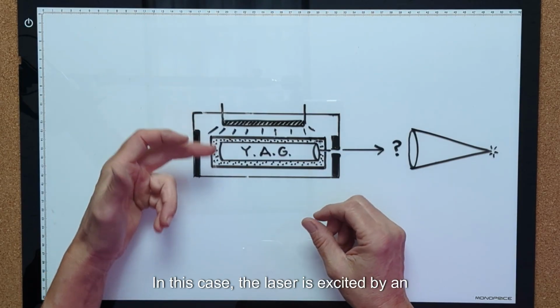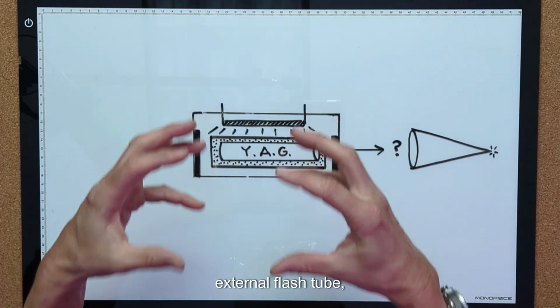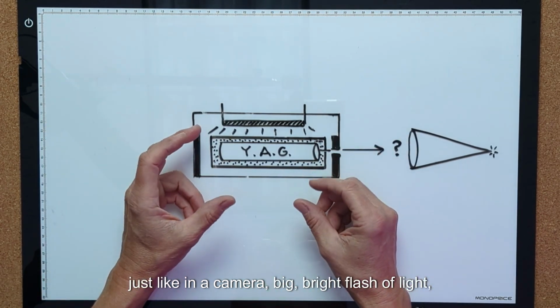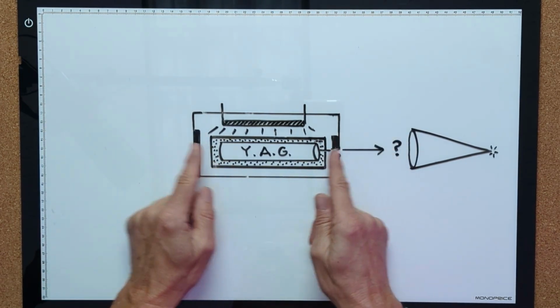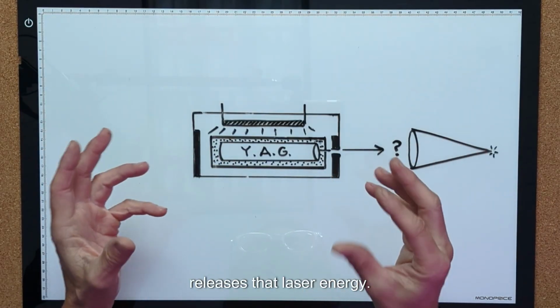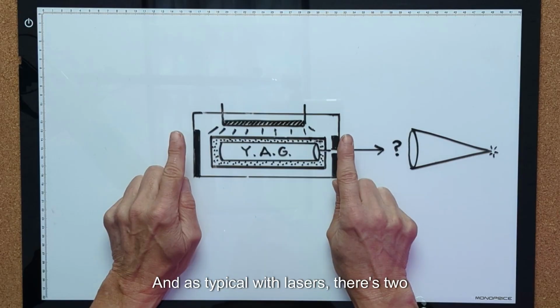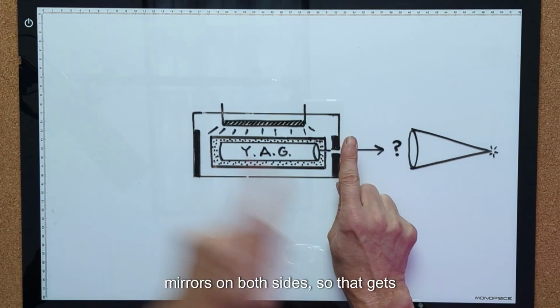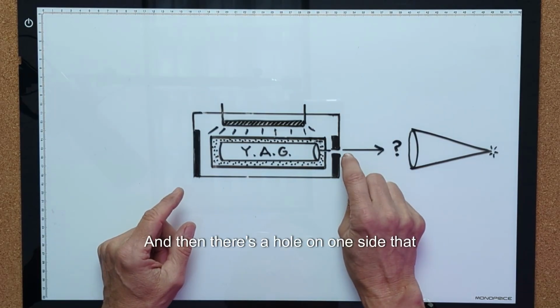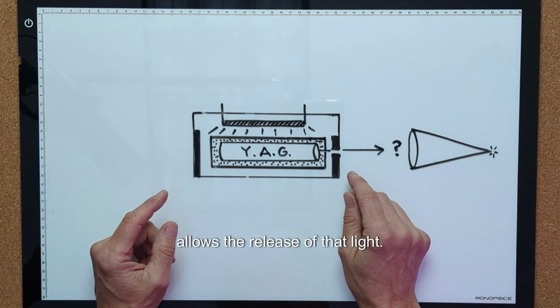In this case, the laser is excited by an external flash tube, just like in a camera, big bright flash of light, and that stimulates it, and then that releases that laser energy. And as typical with lasers, there's 2 mirrors on both sides, so that gets amplified. That's the laser amplification part of it. And then there's a hole on one side that allows the release of that light.